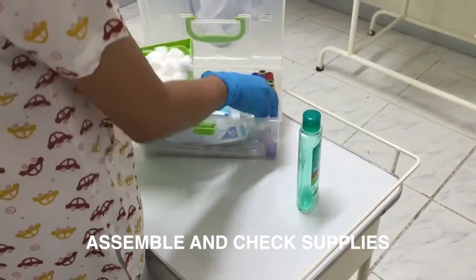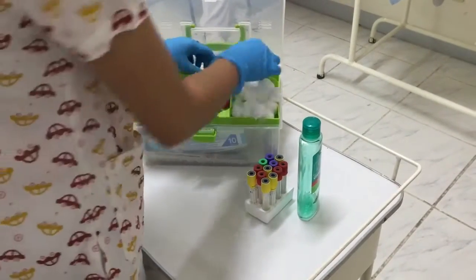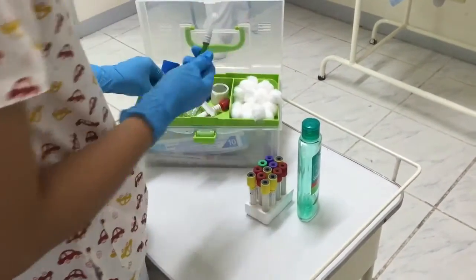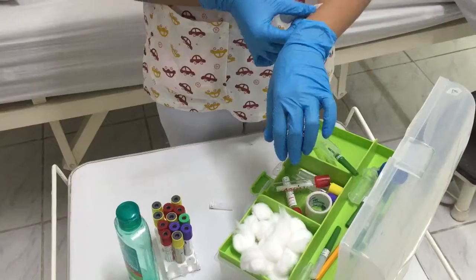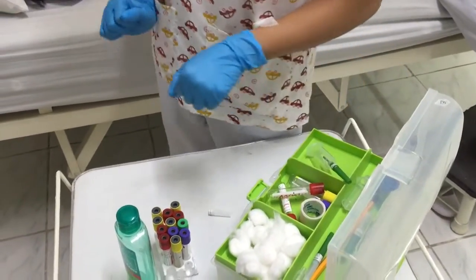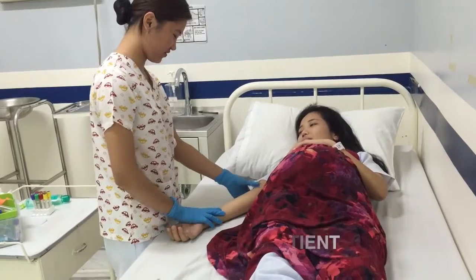Wash hands and put on gloves — wash your hands in a rotating motion using warm water and germicidal soap. Assemble and check supplies: check the expiration dates, cracks in tubes, needles in tubes, etc. Position the patient by moving the arm downward from the shoulders.